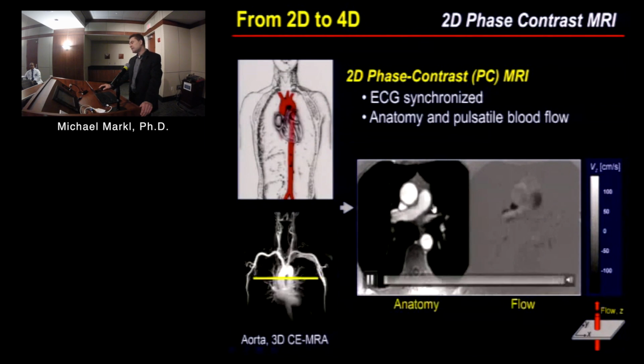artery. And at the same time, you get the underlying blood flow velocities with the same temporal and spatial resolution as the magnitude images. Here, this was a velocity encoding along the through-plane direction. So white means flow is coming towards you. Black means flow is flowing away from you. So this shows you the blood flow velocities in the ascending aorta and descending aorta.